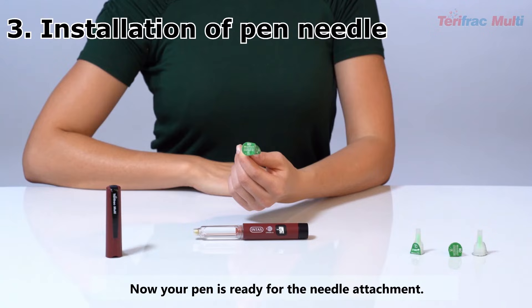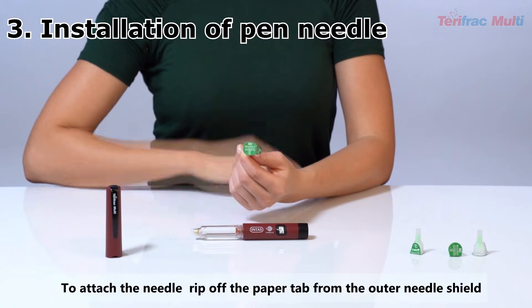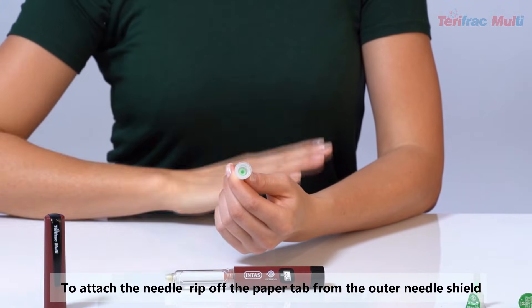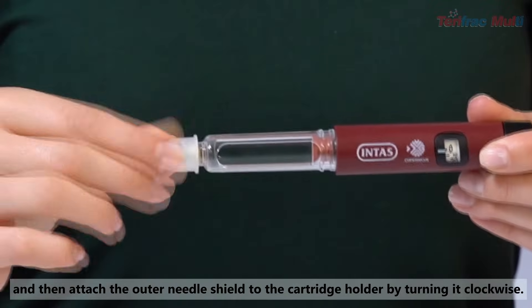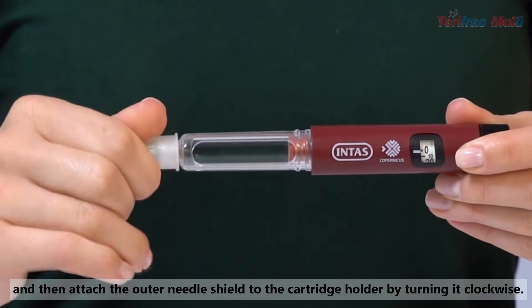Installation of Pen Needle: Now your pen is ready for the needle attachment. Needles recommended for use with TerriFrac Multi are 32 gauge 4 mm pen needles. To attach the needle, rip off the paper tab from the outer needle shield and then attach the outer needle shield to the cartridge holder by turning it clockwise.